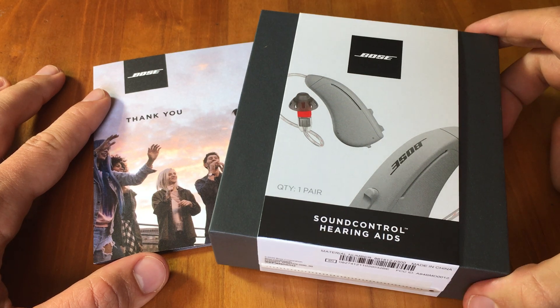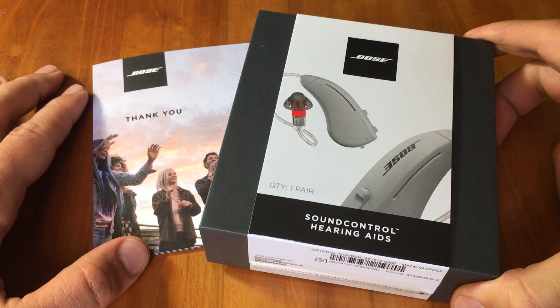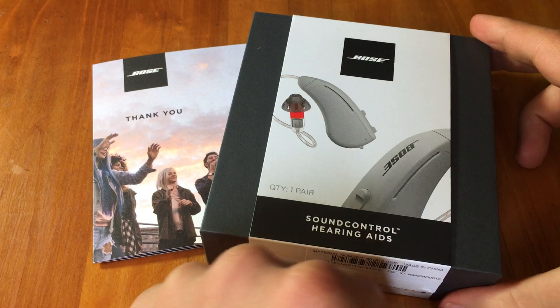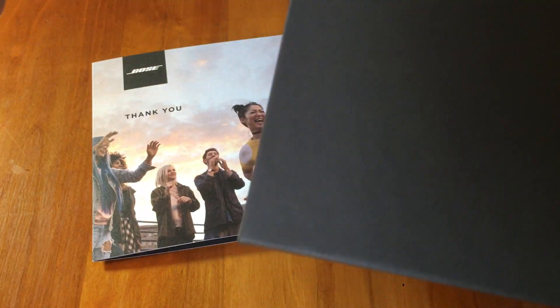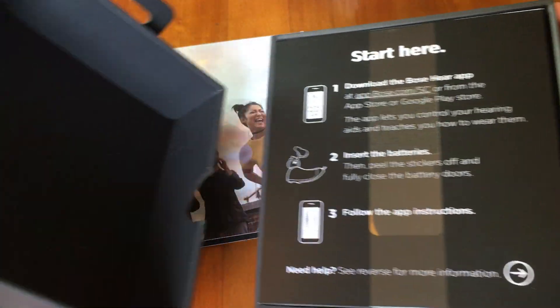This is the unboxing of the Bose SoundControl hearing aids. This is the packaging that came — a thank you card and the hearing aids themselves. Let's open them up from the bottom here. Through this tab you can see that's how you open it up, and then we'll get into the case, which contains the hearing aids.